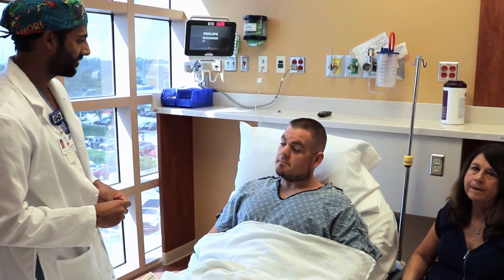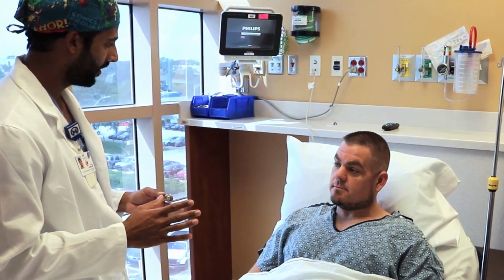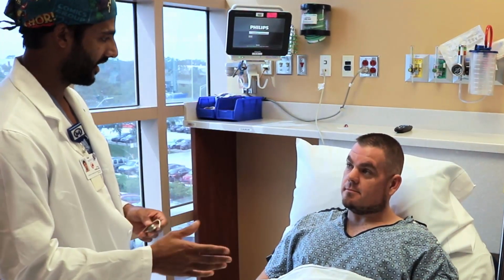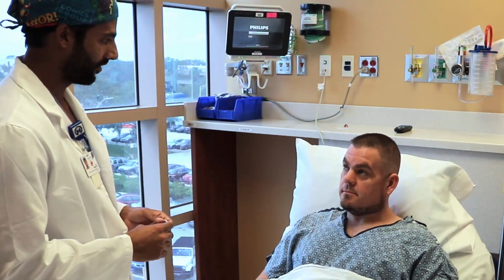Whole procedure usually takes about 15 minutes. After you're done, you'll recover here with us for about an hour. Our nurses will go over education with you about dressing maintenance, about going to swimming pools, onto the beach, all that kind of thing we'll address when you're done.